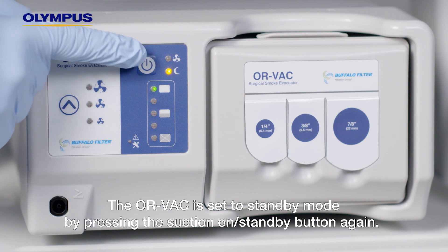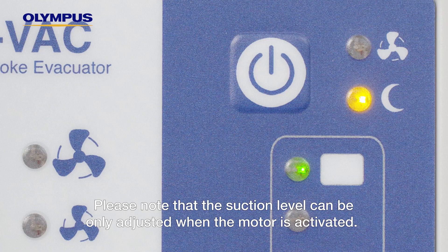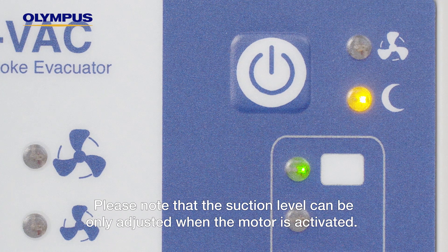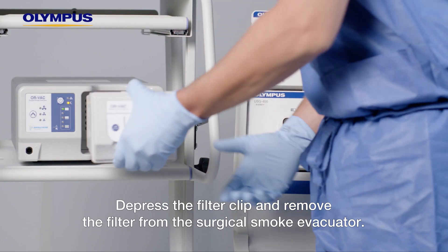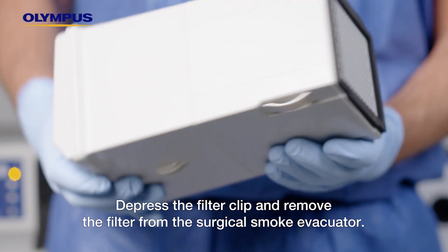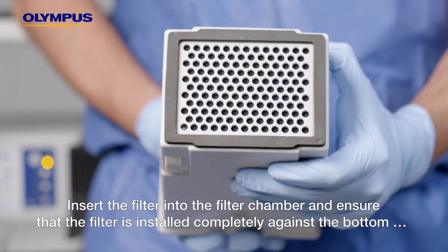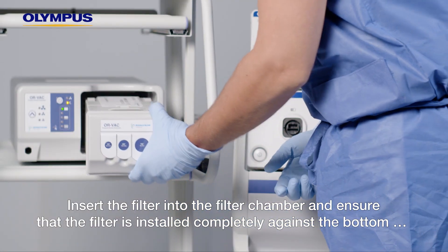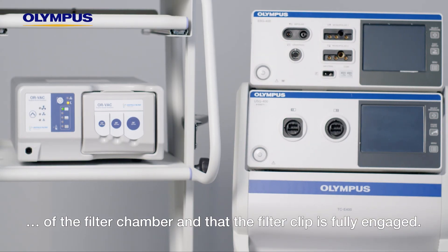The ORVAC is set to standby mode by pressing the suction on/standby button again. Please note that the suction level can only be adjusted when the motor is activated. To remove the filter, please detach all accessories from the filter, depress the filter clip, and remove the filter from the surgical smoke evacuator. Insert the filter into the filter chamber and ensure that the filter is installed completely against the bottom of the filter chamber and that the filter clip is fully engaged.